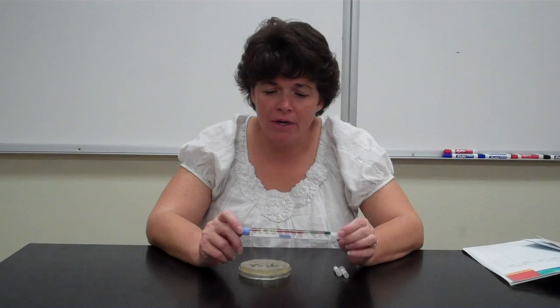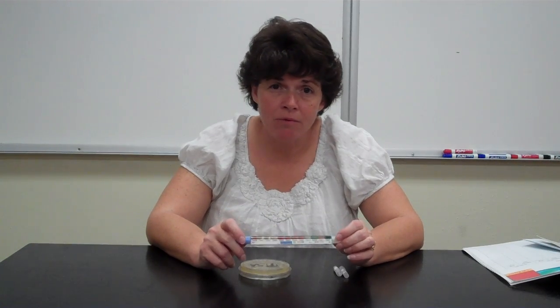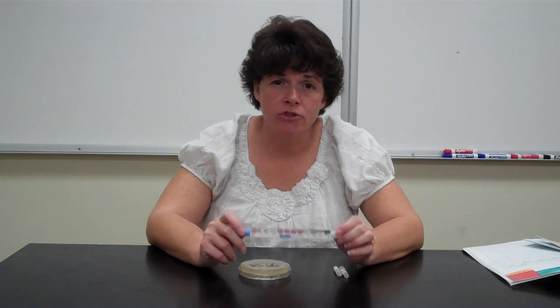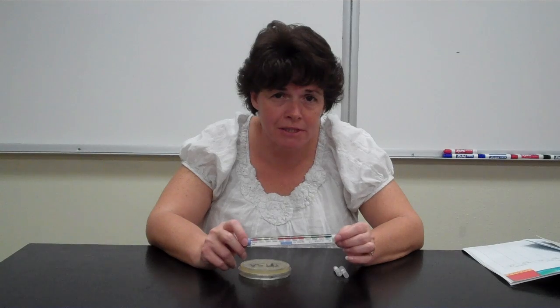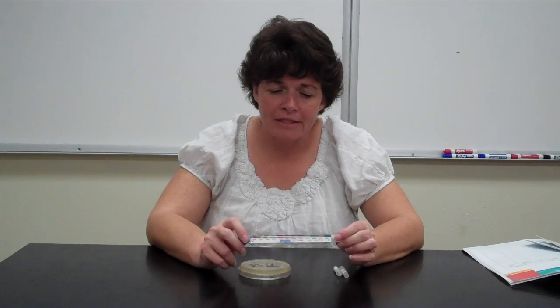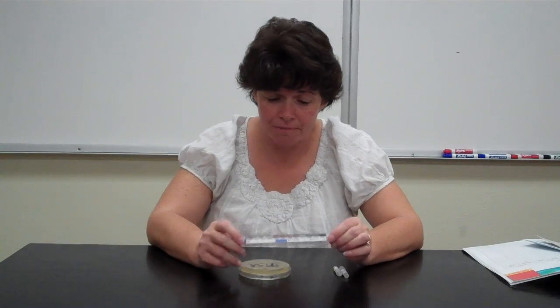So this system right here was designed to test very rapidly, meaning within 12 to 24 hours, the exact microbe that a person has and to treat it with the correct antibiotics. Because remember, we want to try to avoid the use of broad spectrum antibiotics because of the problem with resistance. And figuring out within 24 hours what the patient has is a better route than just giving them some antibiotics in hopes that it treats the infection.